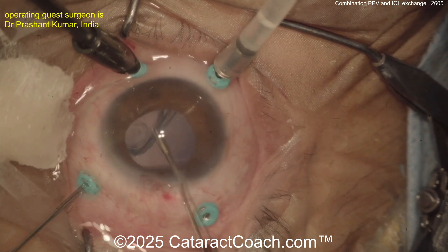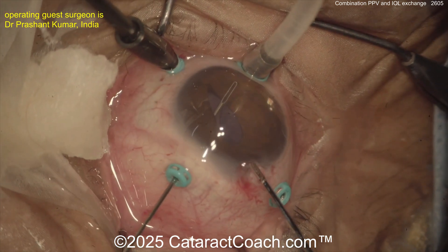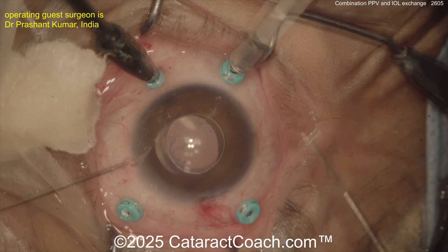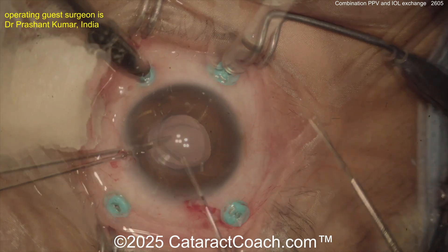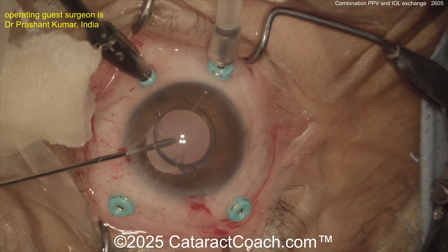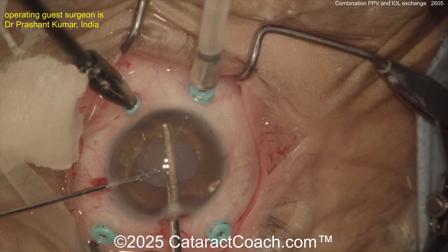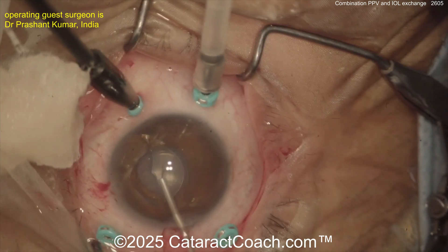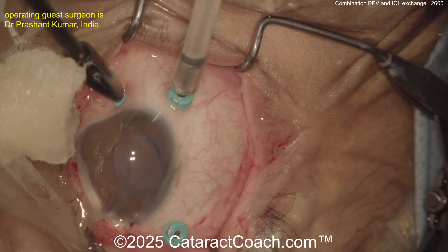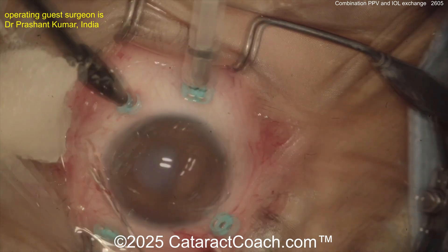It's very important to make sure there's no vitreous entanglement of this lens. One of the mistakes an anterior segment surgeon would make is doing just a little anterior vitrectomy, calling it good enough, then yanking on the vitreous and breaking the retina. That's really the benefit of either performing a combined surgery or getting a retina colleague involved so they can completely clear out the vitreous — it's going to make this a lot safer. Long-term studies have shown that anterior segment surgeons doing Yamane actually have a much higher risk of CME — cystoid macular edema — largely due to residual vitreous-based traction.